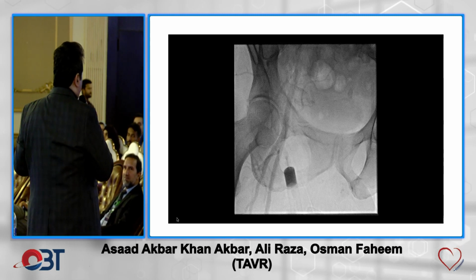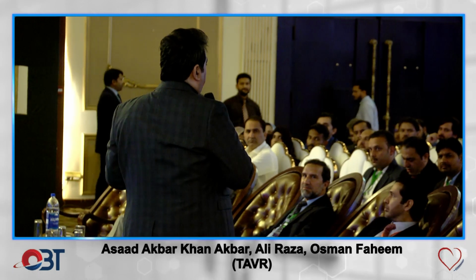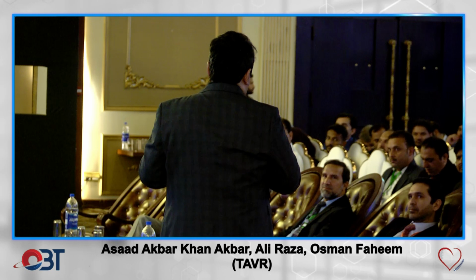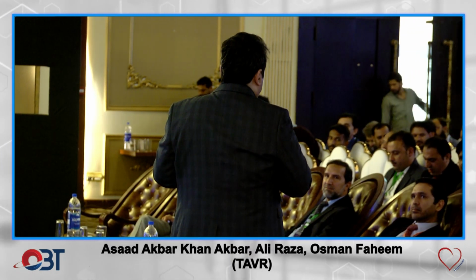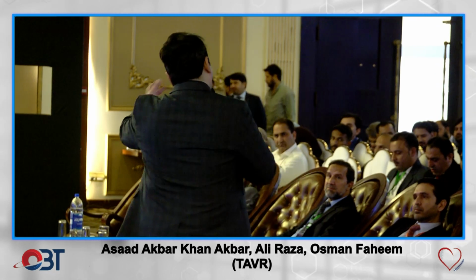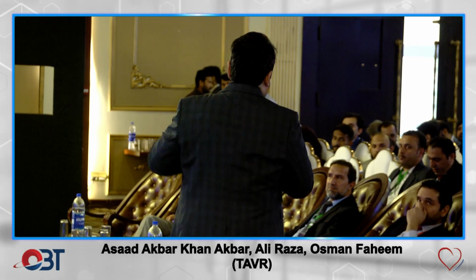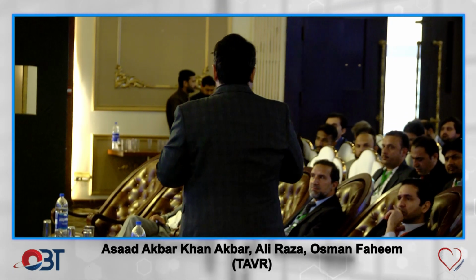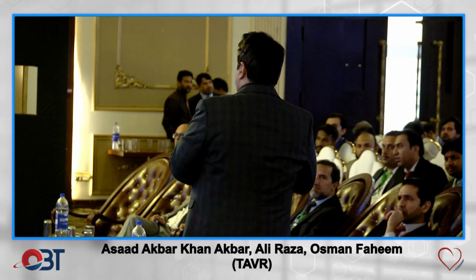My issue is that if you don't enter for a Pro Glide at 12 o'clock position, this Pro Glide will cause you problems actually, because I would recommend that whoever starts should always go for ultrasound-guided access, because once you get experience, then you are confident, and once you reach Osman's level of experience, then obviously you can take these liberties, but not in the beginning. I think in the beginning they should all start with the ultrasound-guided access.